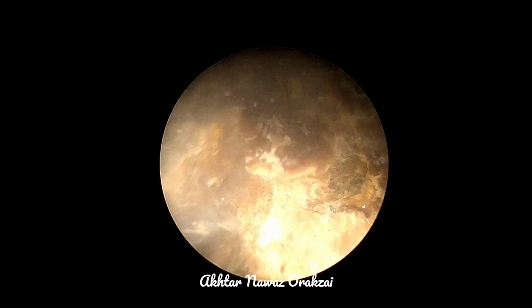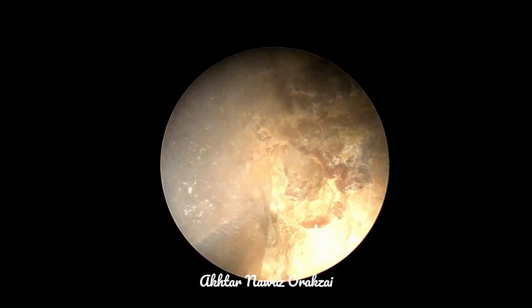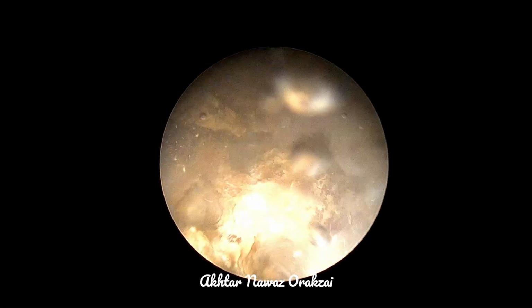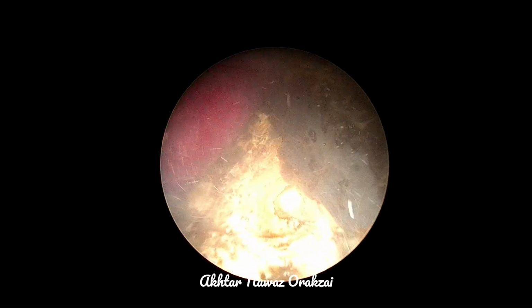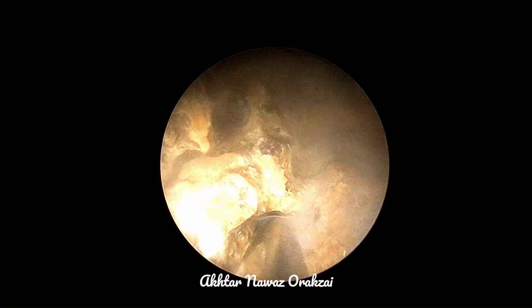So when he was investigated, he was found to have a large bladder stone around 6.5 to 7 centimeters, and also a prostate of around 80 grams. But on cystoscopy, we saw that the bladder neck was a little bit open. However, the prostate was occluding, especially the lateral lobes.